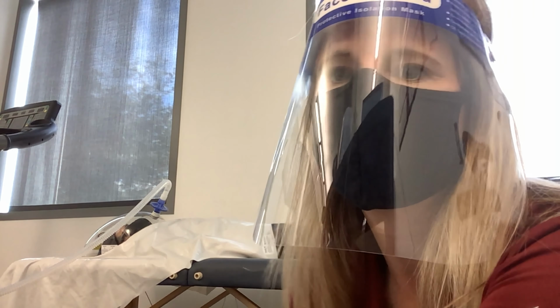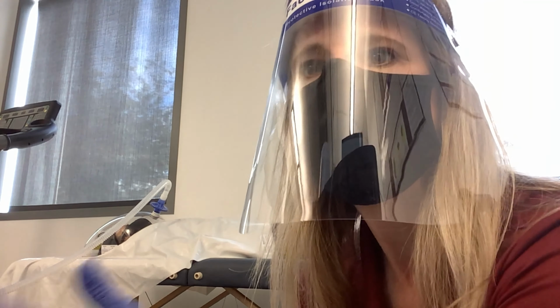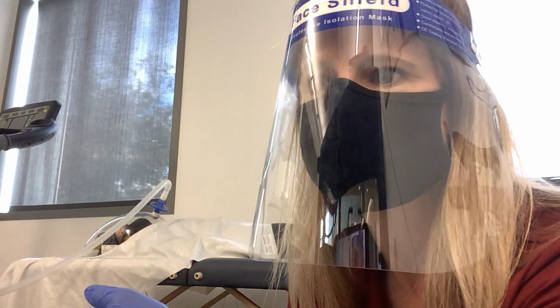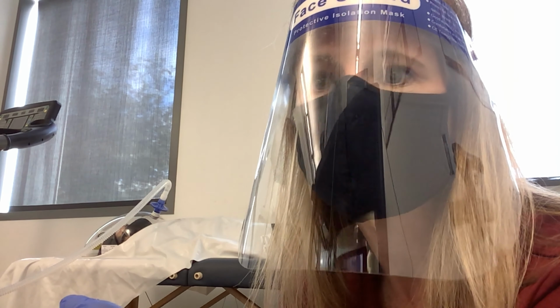This device is going to help us collect the gas exchange that occurs during her restful breathing while we're assessing resting metabolic rate. So already she's been supine and restful for 15 minutes. And now we're going to begin to collect data for 10 minutes using the metabolic cart.